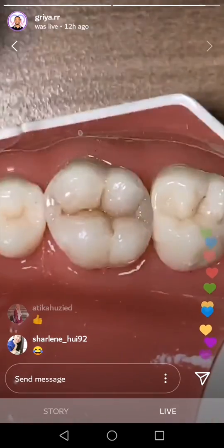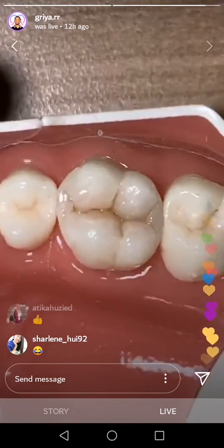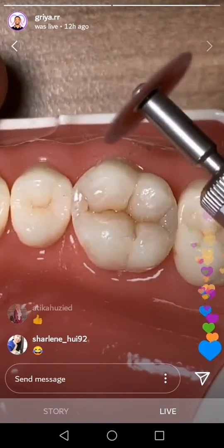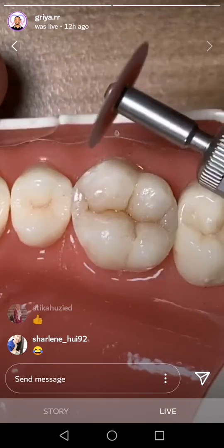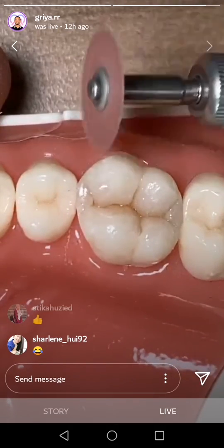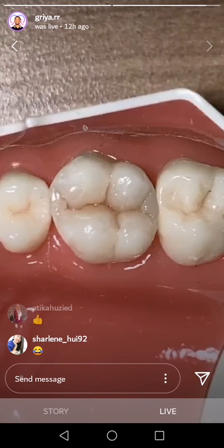Okay. I didn't bring my burr because I don't have the burr. I only have a soft flex.